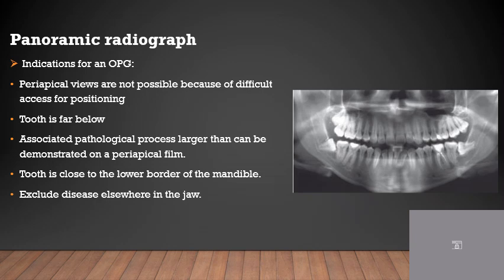So after the advent of OPG, the use of the lateral skull view and the lateral oblique radiograph have come down. And the most commonly used radiographic view to appreciate multiple impacted teeth, be it maxillary or mandibular, can be seen in one X-ray, that is the orthopantomogram.